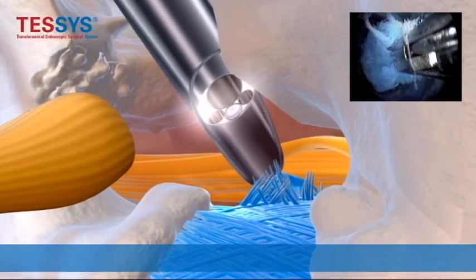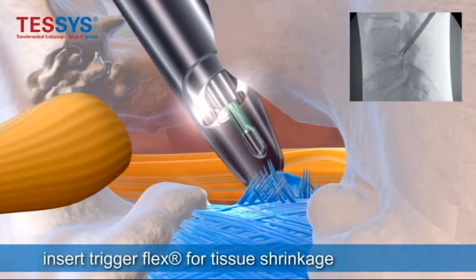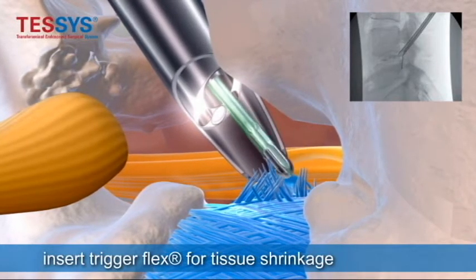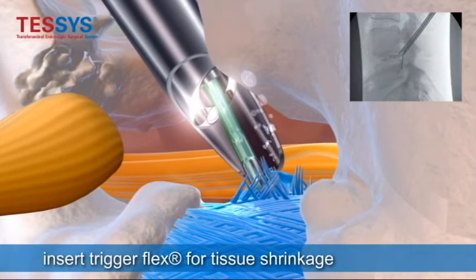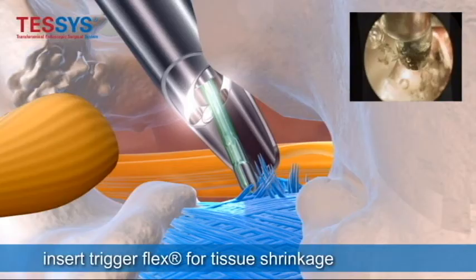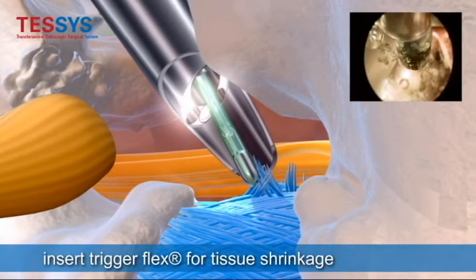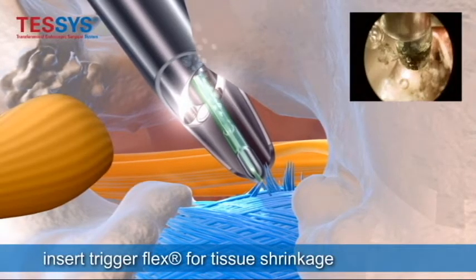Now you come in with the bipolar radiofrequency and you perform an anuloplasty, which seals the annular tear that you find in the disc — the actual defect where the herniation came out of. It will also take down some excess debris from the herniation, so that the tear will heal up on its own.